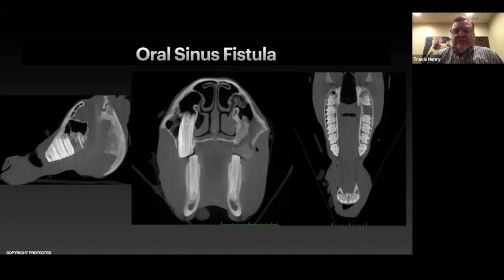And what I find with these in these cases is that the plug does keep the majority of the food out, but it also acts like a pump. So when they're chewing on that, they're actually just pumping things around it and pumping food up through it. And I think that's why when we put these solid, hard bridges in these horses and bond them to the teeth, we actually help to stabilize things here, and it doesn't act like a pump. And then it also puts pressure on the bone as they're chewing on it, and it's amazing how fast this bone will fill in.